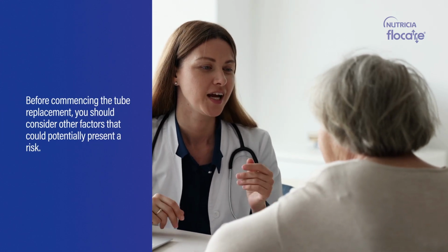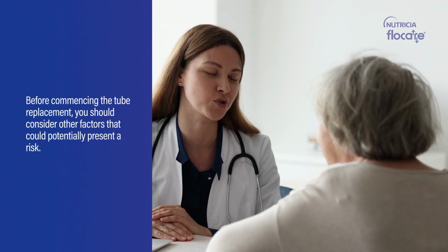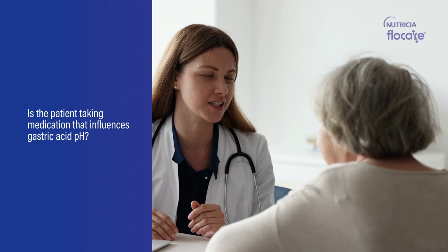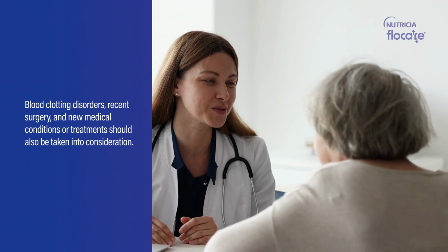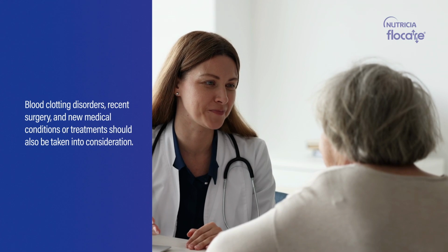Before commencing the tube replacement, you should consider other factors that could potentially present a risk. Is the patient taking medication that influences gastric acid pH? Are they receiving time-critical medication? Blood clotting disorders, recent surgery, and new medical conditions or treatments should also be taken into consideration.